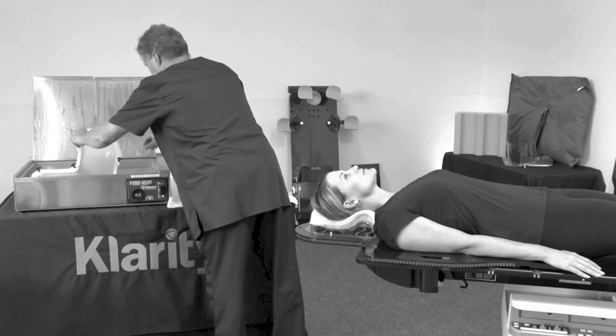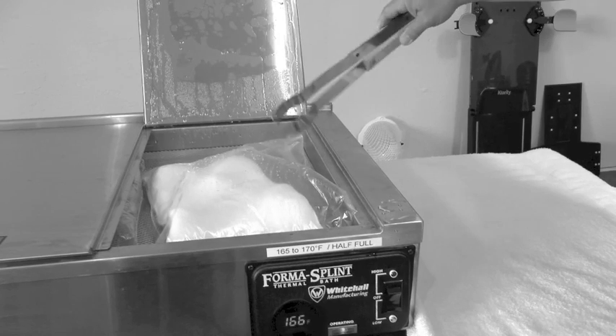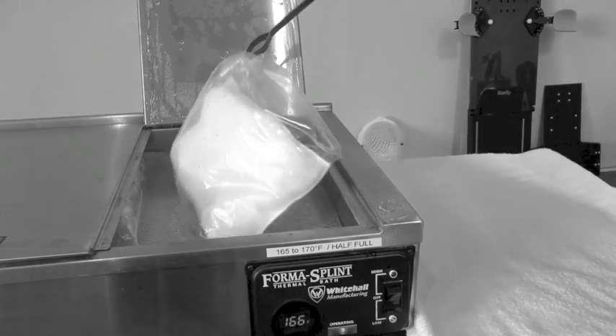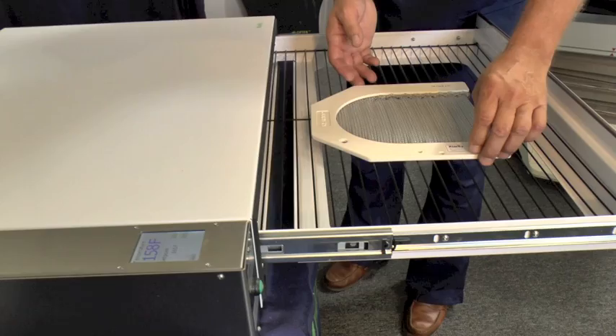Tired of changing water and hassling with your hot water bath to produce thermoplastic masks? Frustrated by having to use tongs just to retrieve a product out of the water bath? Now there's a better alternative — the new Clarity Oven.